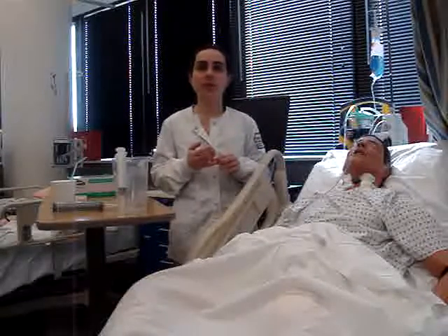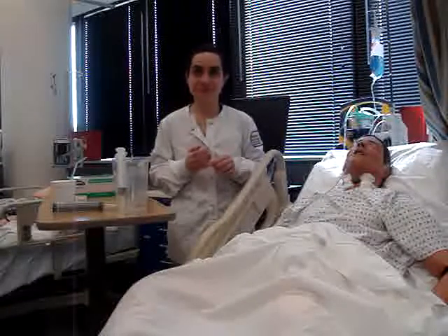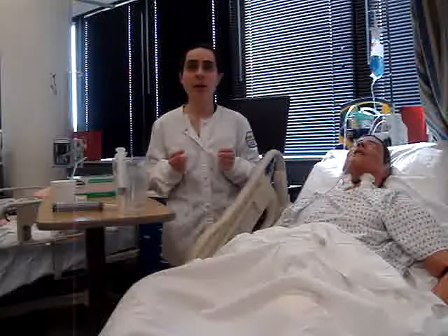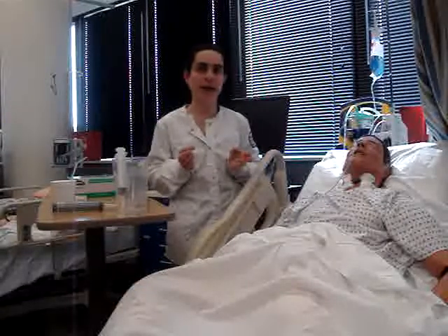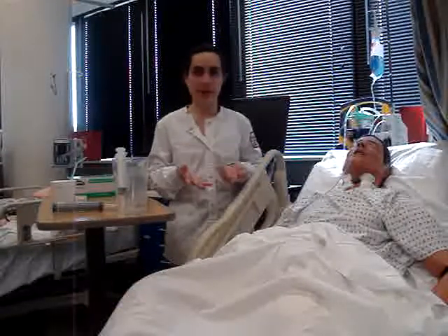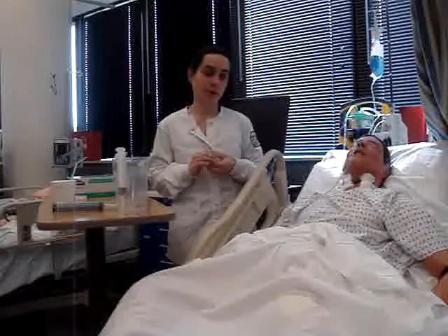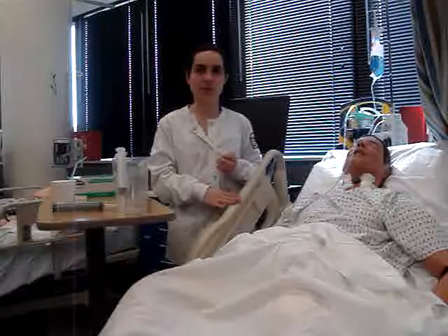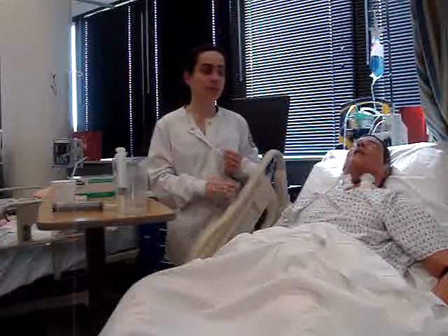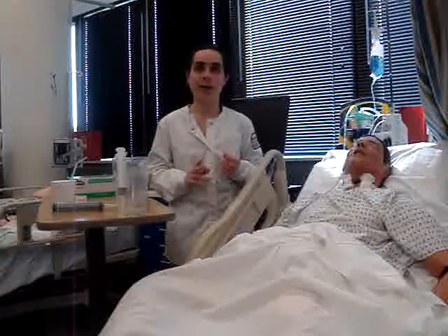I'll flush the feeding tube with 30 milliliters of sterile water again, and I'll also rinse the feeding bag and the tubing. I will clamp my tubing, and I'll disconnect the feeding setup from the feeding tube. What I want to do is maintain the patient in an upright position of at least 30 to 45 degrees for at least 1 hour after the feeding, so they don't aspirate.